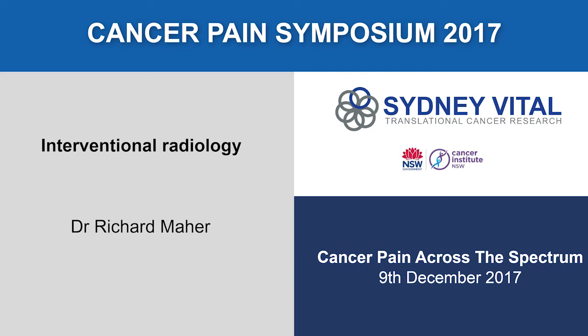This is actually someone who was having a workup for a T12 vertebrectomy. That area of black, this is a digital subtraction angiogram, so all the bones have been subtracted. That's actually enhancement of a tumour inside the T12 vertebral body. So this patient, this was a preoperative embolization for Paul Stalley, and we had a long talk about it and we woke the patient up, which we do anyway between the embolization and the operation, and she decided to not have the operation because of the high risk of paraplegia after it.